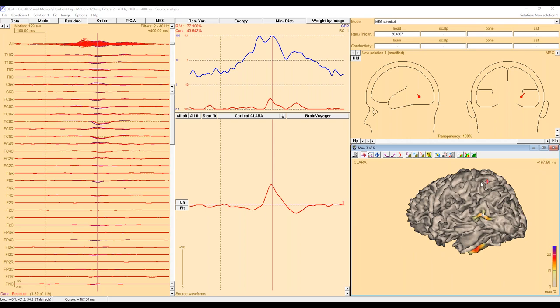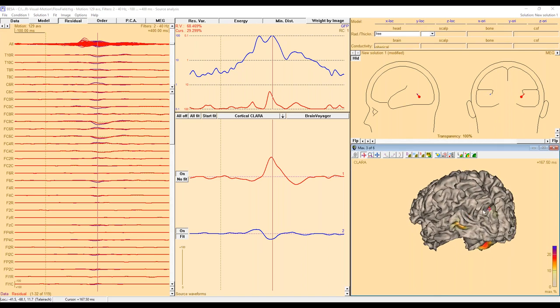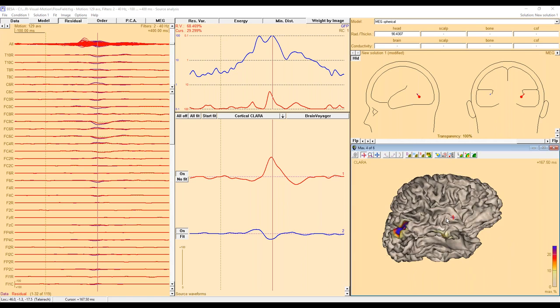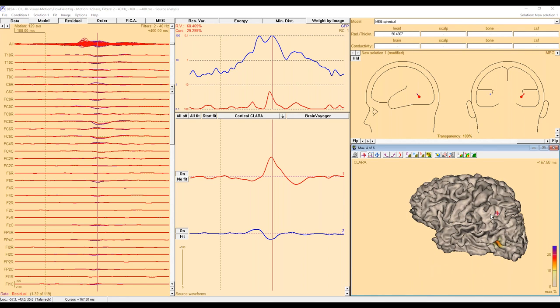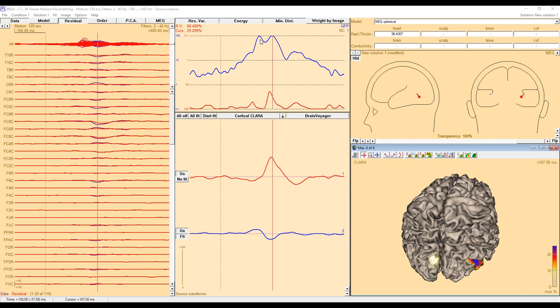Again, I could see the source from here. Just simply press this button here. And I can have a look at the other maxima, and as far as I remember, there's something here, also quite interesting, in the inferior temporal cortex, which is also often named in the visual pathway. So I could use that too if I wanted to explore that further. The maxima are sorted by highest activity first and then lowest, but I can also now go back to my first maximum and see dipoles from there for the initial primary cortical activation.